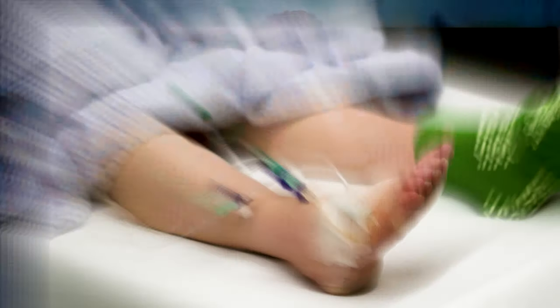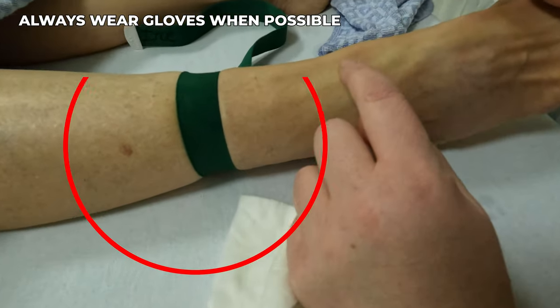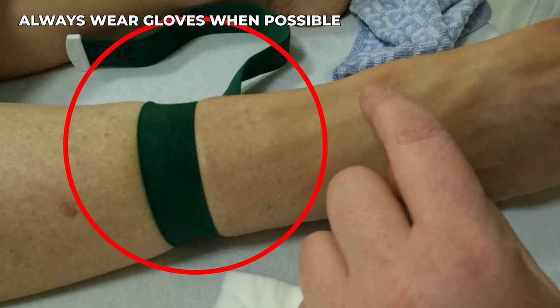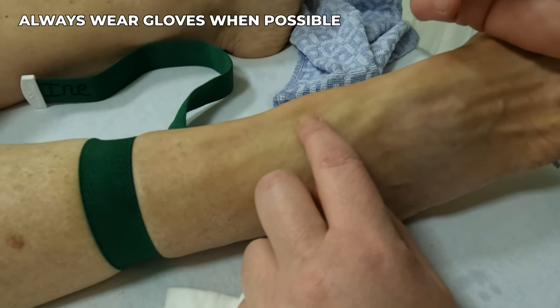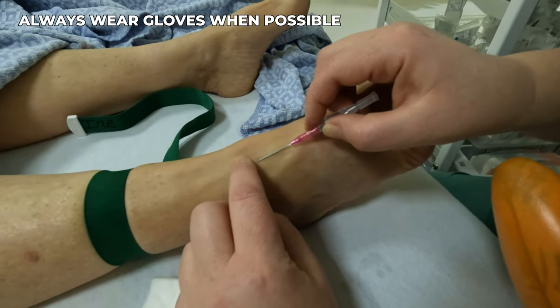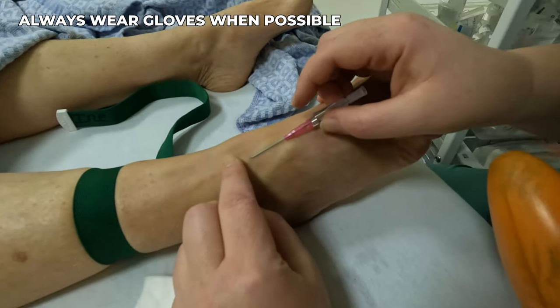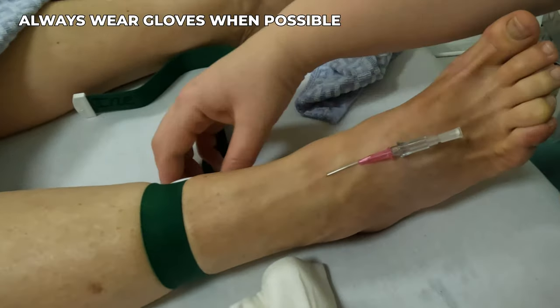Starting an IV in the foot can indeed pose a challenge, and the reasons for this are manifold. One of the most frequent issues encountered is due to a lack of determination during the execution phase. The process typically starts smoothly enough with the operator applying a tourniquet correctly to engorge the peripheral veins in the foot, but when it comes to actually inserting the IV catheter, a lack of swift and decisive action often results in the vein being pushed aside rather than being pierced by the catheter.